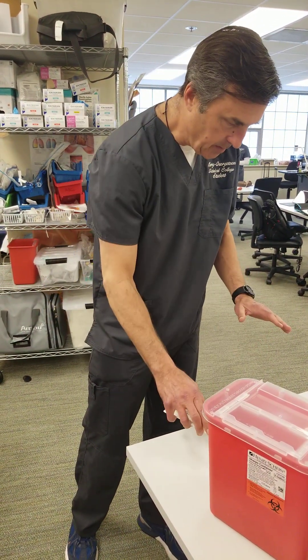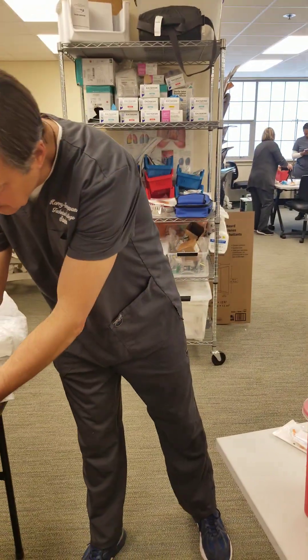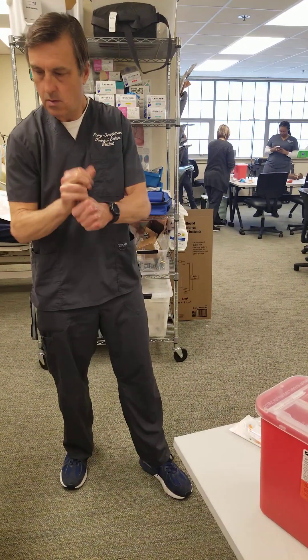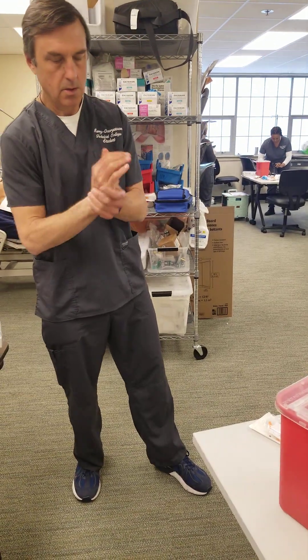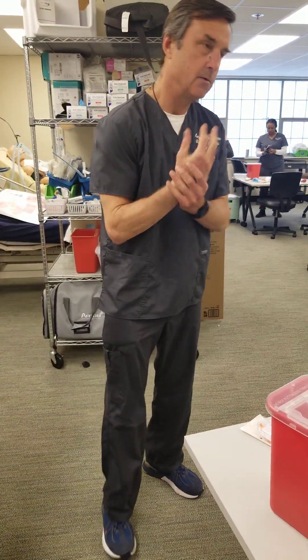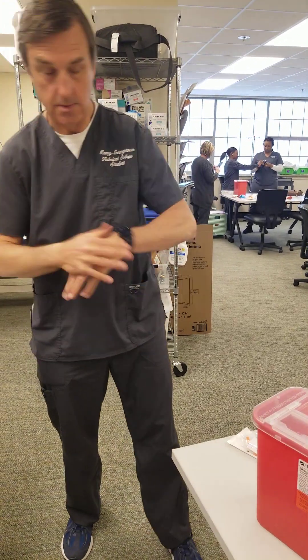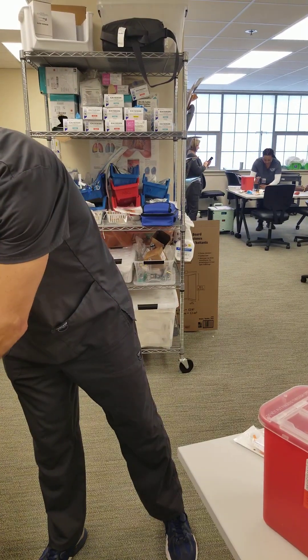I've got my equipment. I'm going to prepare to go into the room by washing my hands — never try to put the gloves on before your hands are completely dry because it just takes a really long time that way. Then I'm going to glove up.